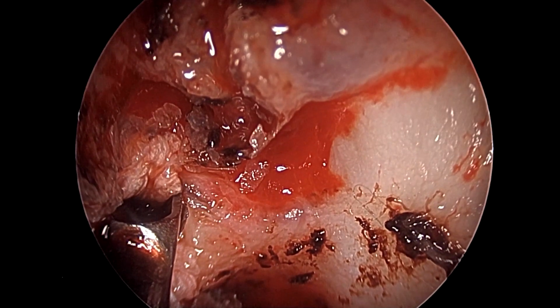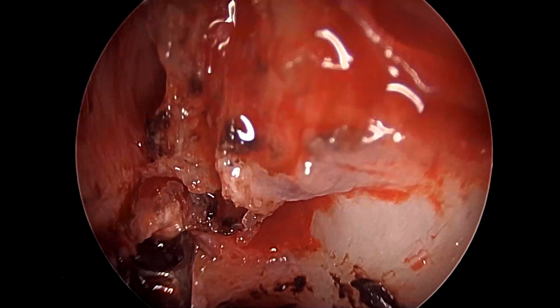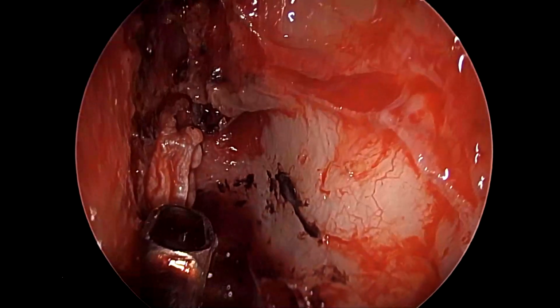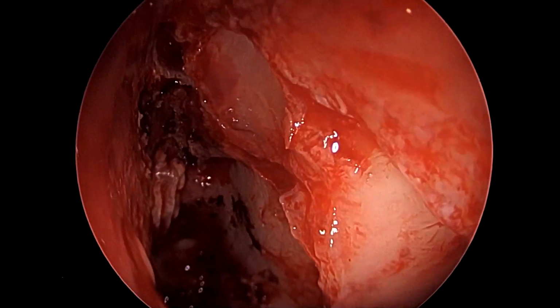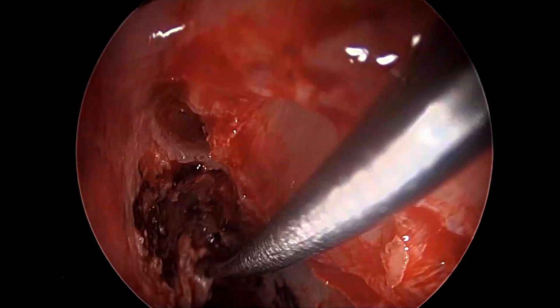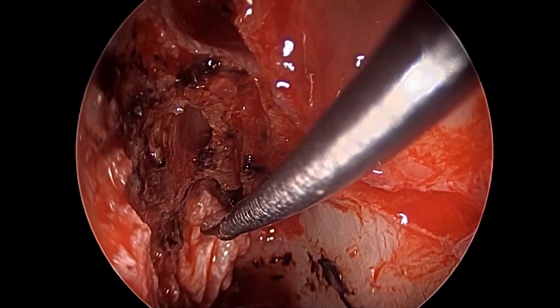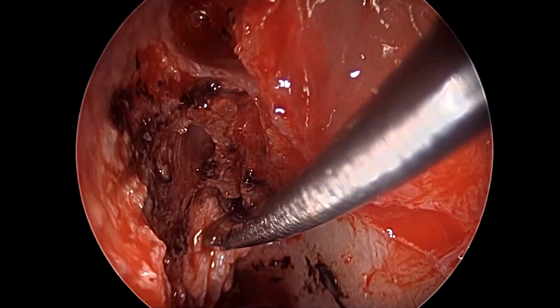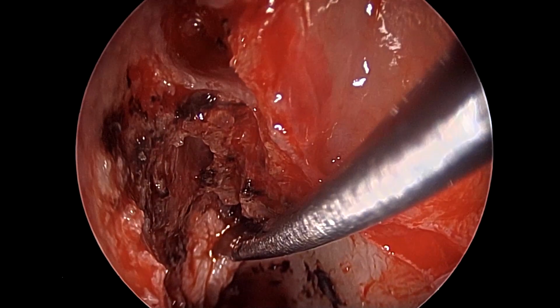We strictly don't advise the use of ball probes here, because ball probes almost always pull back the fascia that we have insinuated in between these structures, and are strongly not recommended for this step. Flat, blunt elevators are the best instruments for this part. We again do not recommend either ball probes or any sharp elevators.